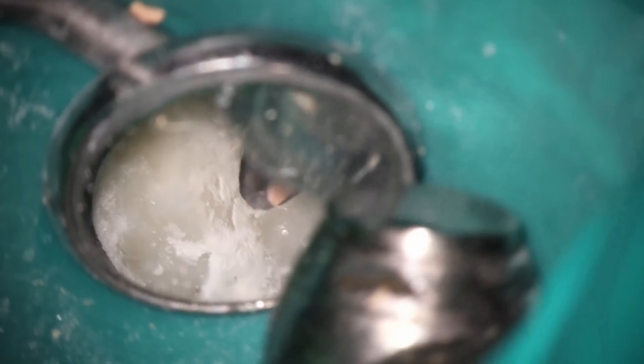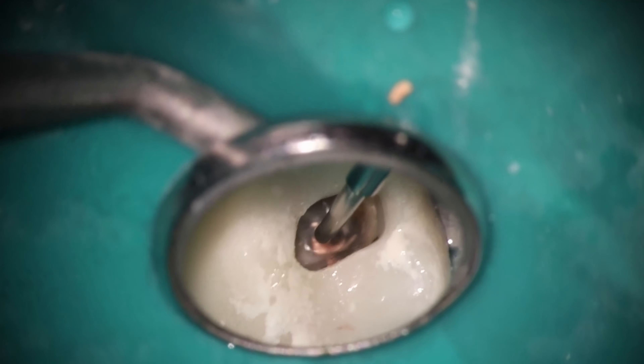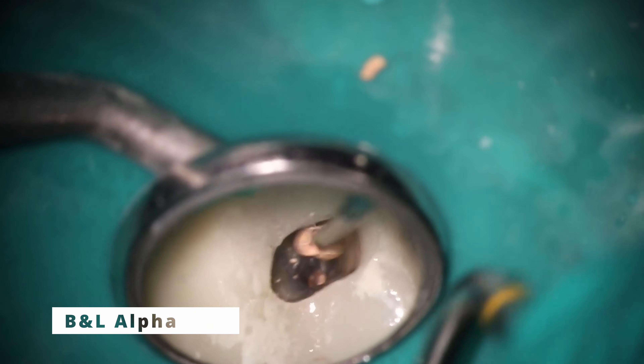When we're removing the composite here, I like to remove the bulk of the gutta percha. Another thing that was kind of popular was to fill the chamber a little bit with gutta percha, and I've just found that it makes retreats really messy. So if you're already going to be in there, hit it with the bur and it'll come out. The one time you don't want to do this is if it is a thermophil case — you want to keep those carriers up as high as possible to make it far easier to grab and remove.